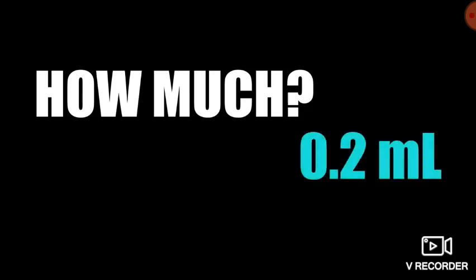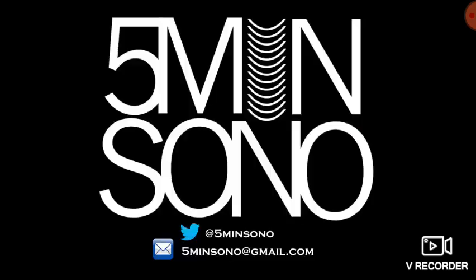And they found that 0.2 mLs had good sensitivity and specificity. It was in the high 80s, both sensitivity and specificity. It's not perfect, but it is better than anything else we have at the bedside, including our physical exam, our stethoscope, and our x-ray. CT scan is definitely the gold standard, but we may find ourselves in scenarios where we can't get one right away, or we want to diagnose them fast. And in this case, the ultrasound definitely comes in handy.